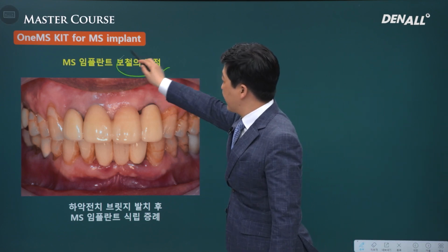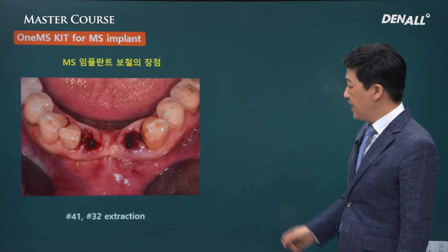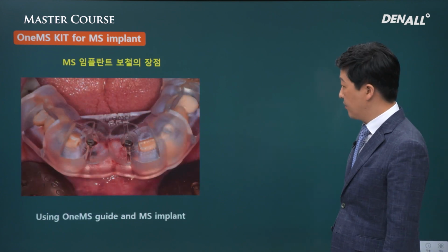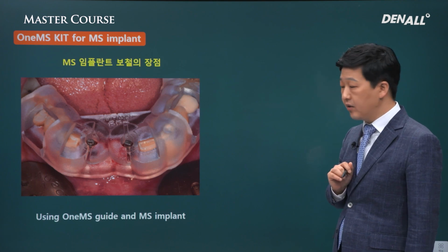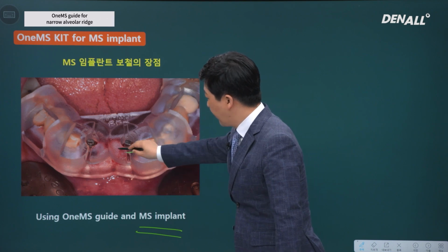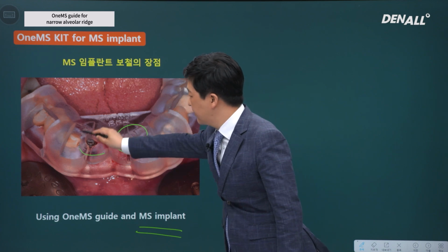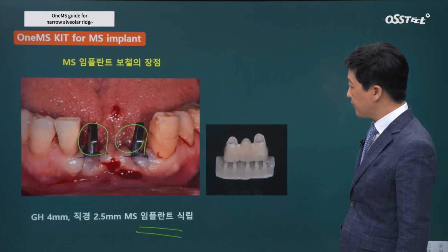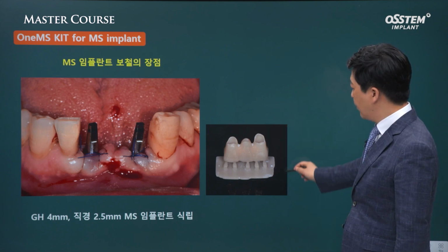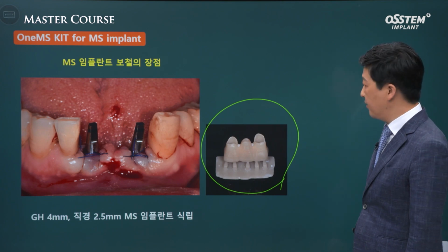I want to talk about the benefit of MS implant prosthesis. As shown, number 41 and 31 were extracted. OneMS guide was used to place 2 MS implants in the planned area. They were accurately placed in the determined area. It was placed like this. A suture was done. 3D printer was used to provide provisional.